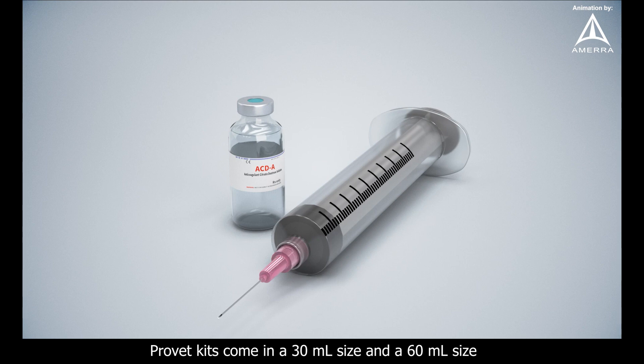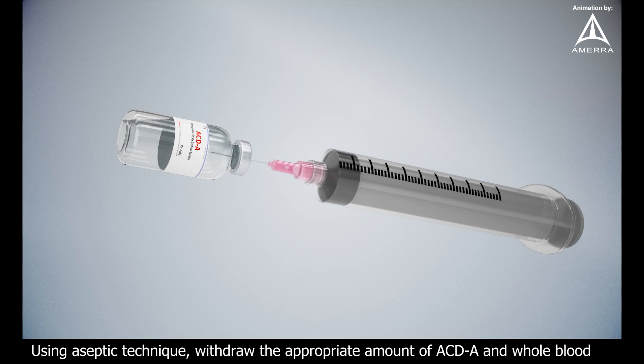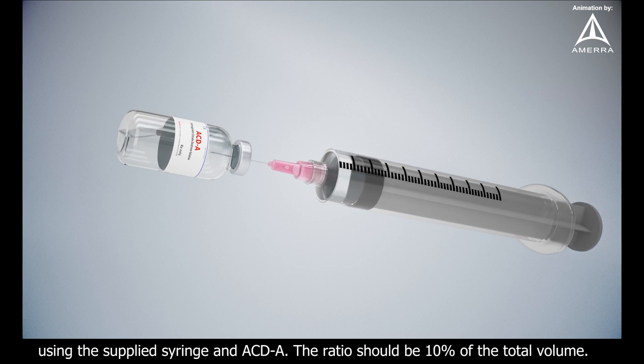ProVet kits come in a 30 ml size and a 60 ml size, allowing for PRP processing for all sizes of animals. Using aseptic technique, withdraw the appropriate amount of ACDA and whole blood using the supplied syringe and ACDA. The ratio should be 10% of the total volume.